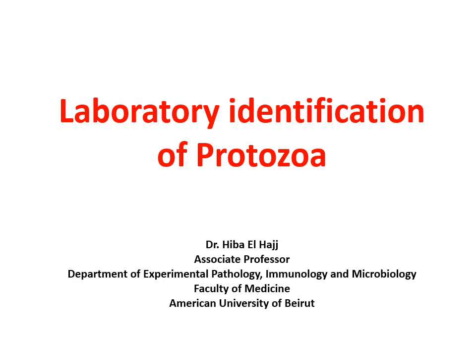Good morning, everyone. The scope of this session, entitled Laboratory Identification of Protozoa, is to show you how to identify stages from select protozoa in the relevant clinical specimen of an infected patient.